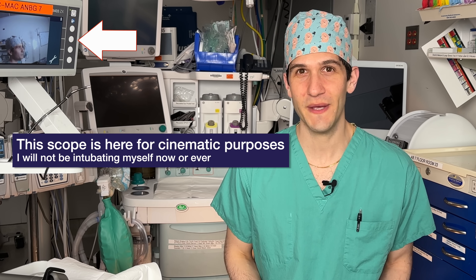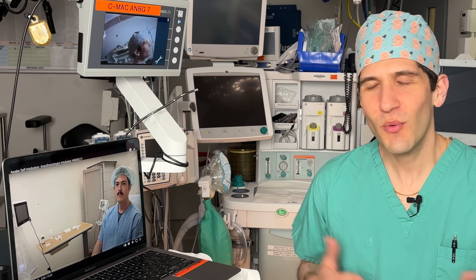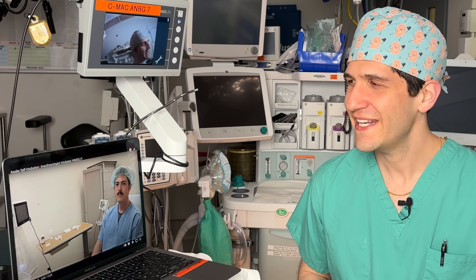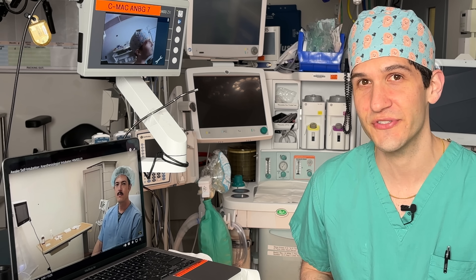This video does not contain medical advice, but it does contain footage of a person being intubated — not me. Before we get too far, I want to highlight each important part of the procedure from start to finish. This gentleman featured in a YouTube video I've linked here, named Dr. Ian, is actually going to intubate himself, and I'll talk through the highlights of what exactly he's doing.